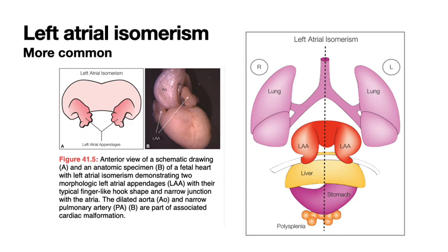Here you can see the actual picture of the pathetic little left atrial appendage, a little finger-like, hook-like thing with a pretty narrow base. So the pathologist will use this to classify them because it's so obvious to them which it is. And you can also actually tell on echo after birth fairly easily too.